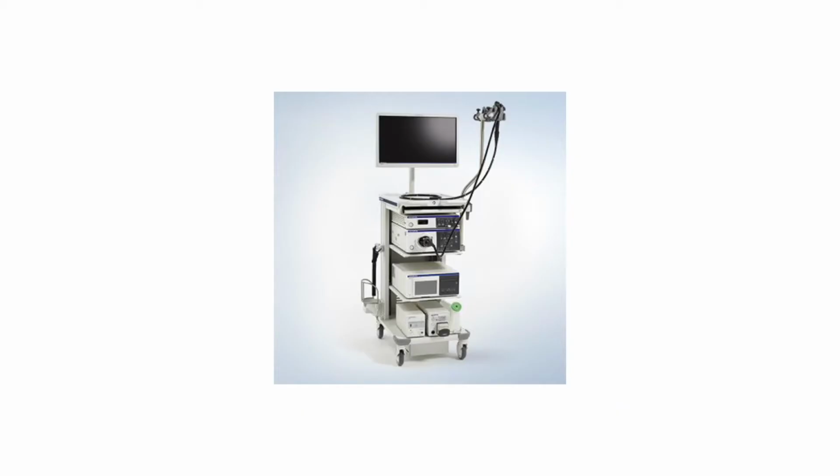Today I'll be presenting design considerations for the modern operating theatre, specifically medical audio and video systems. Modern operating theatres incorporate a lot of high technology equipment. In the video world, this is endoscopes, laparoscopes, fluoroscopes, CT scanners and even X-rays.